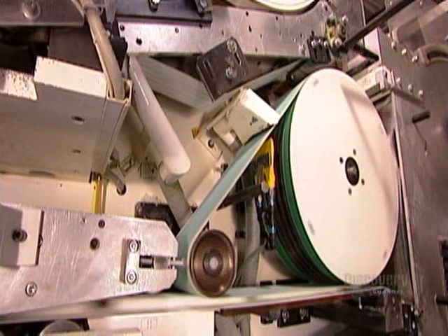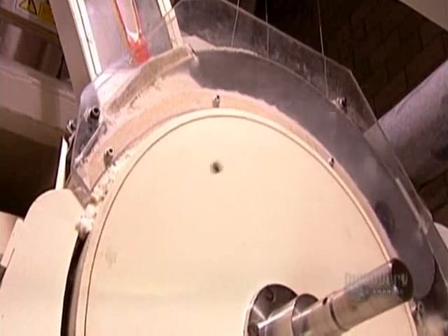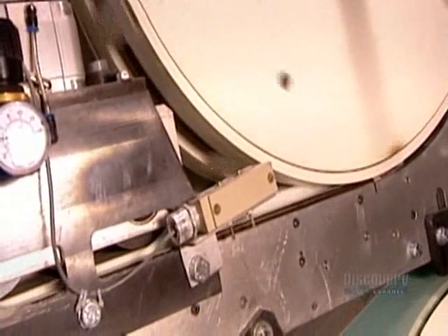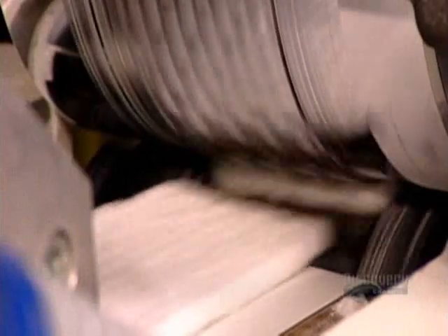This one is smaller, rectangular, and at least double the density of the first layer, meaning it has more cellulose compressed into a smaller size. The compression roller also embosses a pattern that will disperse the menstrual flow, helping absorption.